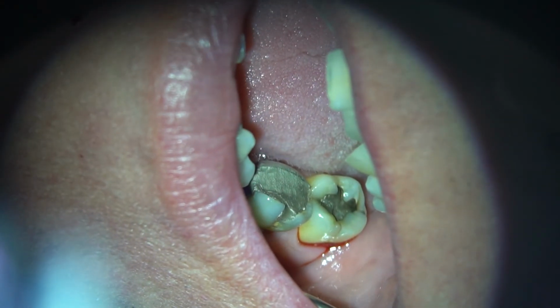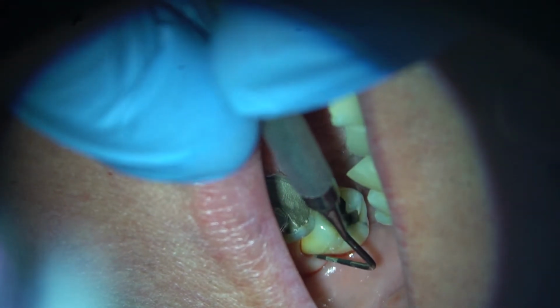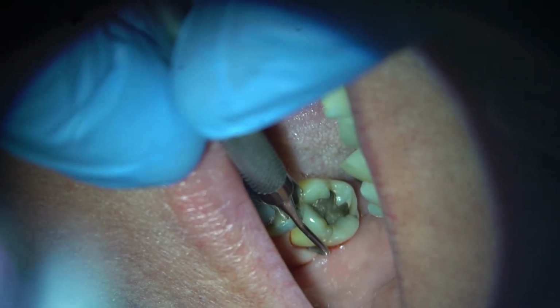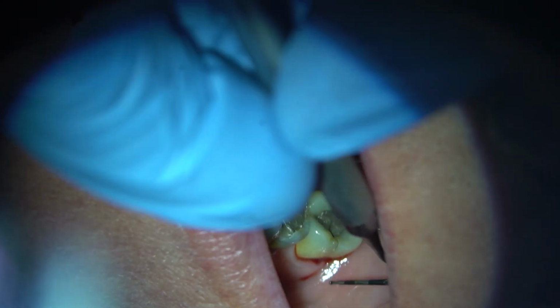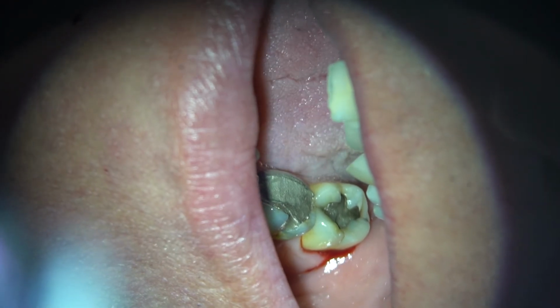Bone and periodontal ligament breakdown along the line of the fracture can often be detected as an isolated periodontal pocket. The gingival sulcus is examined using a BPE or perioprobe, as can be seen here. Note that the probe disappears into the area of tissue breakdown, which is adjacent to the suspicious fracture line.